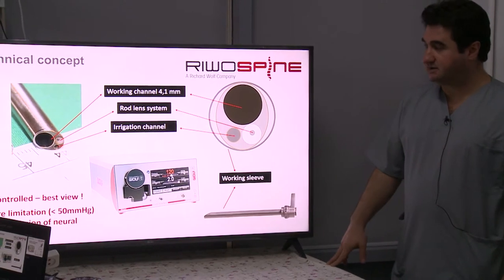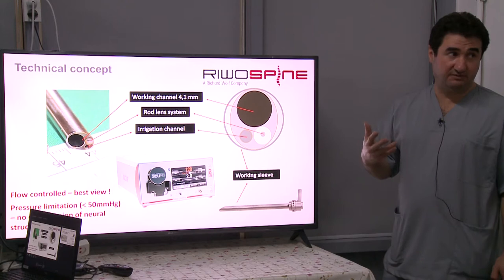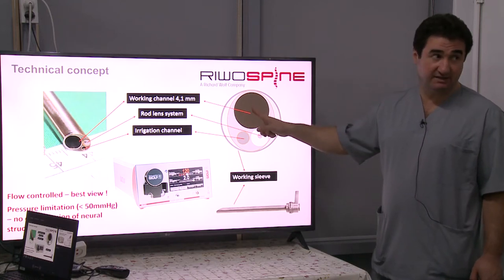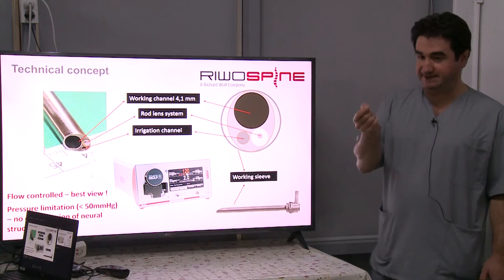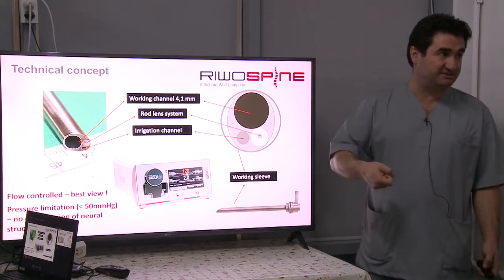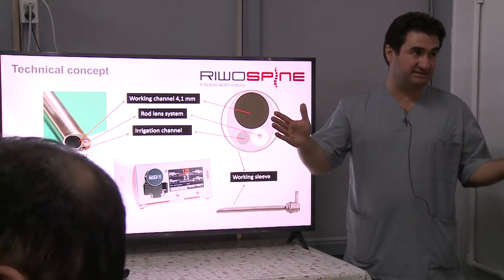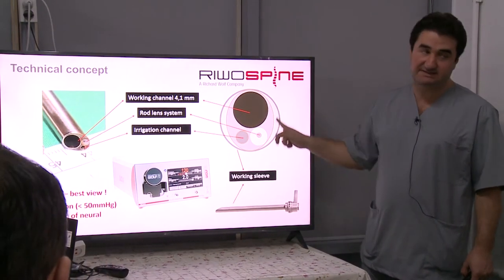If you need to get outflow, we have two possibilities. One of them is these spaces. The other one is the working channel. But if something blocks the working channel, like a piece of disc, or if you work with the 4 millimeter instrument, then you block this and you cannot get outflow. By this way, you increase the spinal canal pressure. To prevent this is very important.